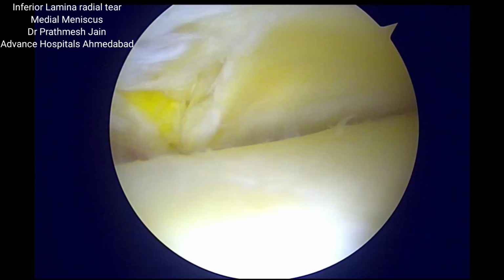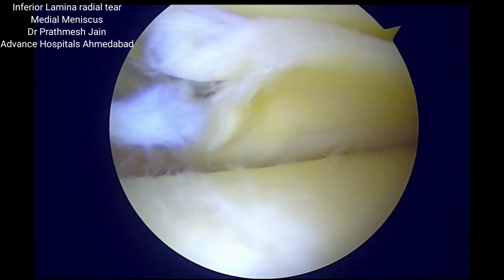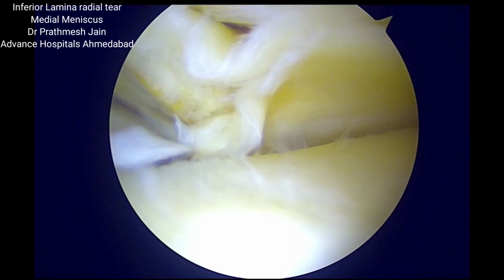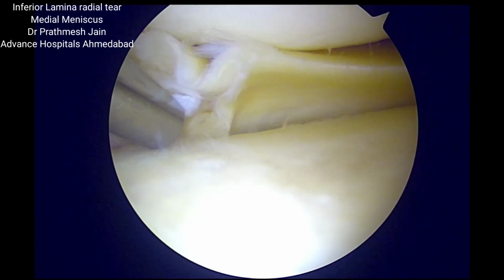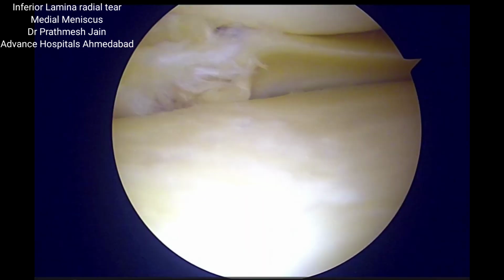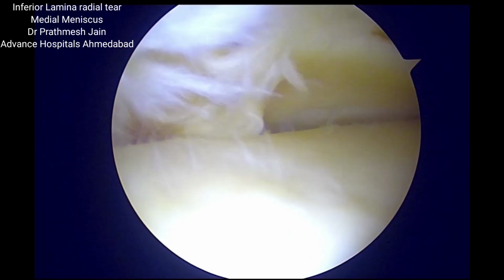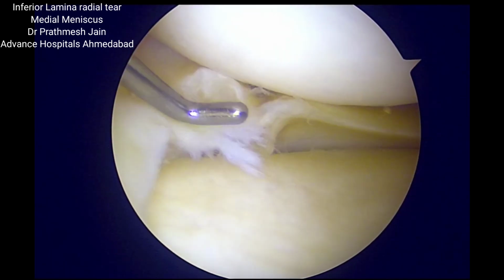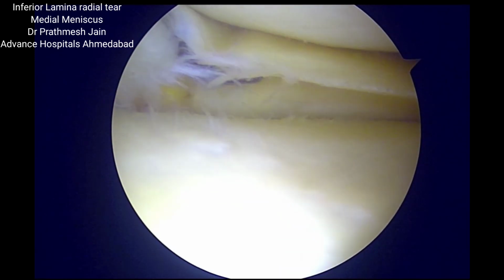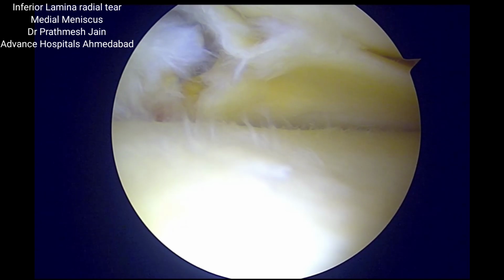Radial tear of the inferior lamina is an unusual pattern of complex meniscus tear where one of the two flaps, that is the inferior and the superior, so the inferior flap of the medial meniscus has got a radial tear. This is a bad pattern because it decreases the hoop stresses of the meniscus significantly, and because of the radial tear the load transmission comes directly from the femur to the tibia.